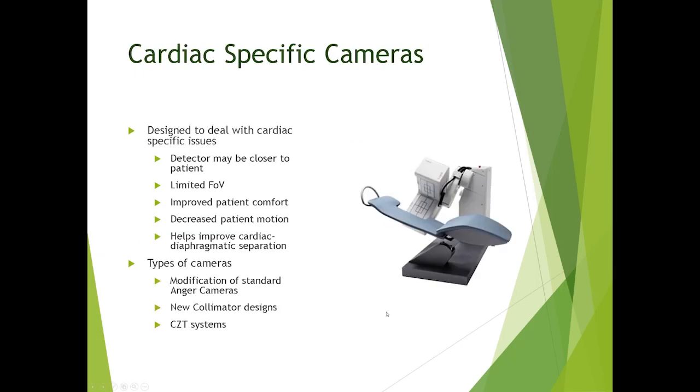So speaking about cardiac-specific cameras and SPECT-CTs, cameras have been designed to deal with cardiac-specific issues. As you can see, for example, in this specific design here, the basic concept of having two heads is similar to a general SPECT camera, except the heads are smaller, so there's a limited field of view, but it also allows the detectors to be closer to the patient.